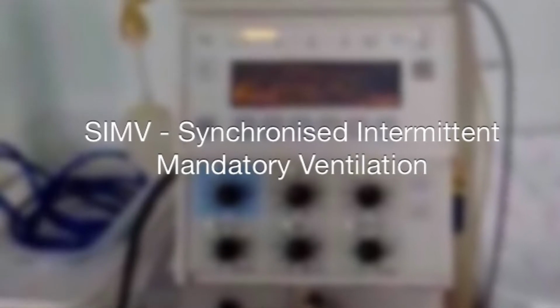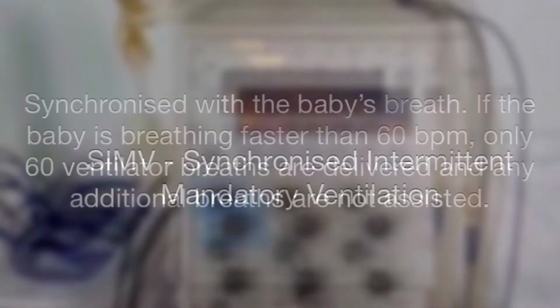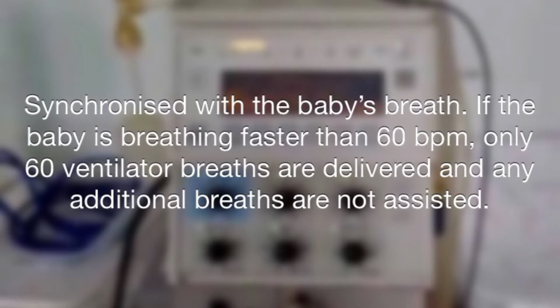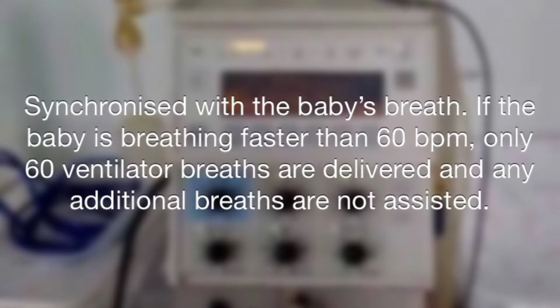Next is SIMV or Synchronized Intermittent Mandatory Ventilation. Synchronized with the baby's breath. If the baby is breathing faster than 60 breaths per minute, only 60 ventilator breaths are delivered and any additional breaths are not assisted.